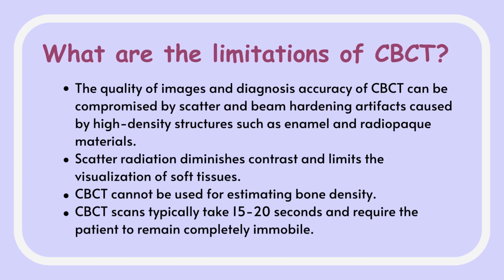What are the limitations of CBCT? The quality of images and diagnostic accuracy of CBCT can be compromised by scatter and beam hardening artifacts caused by high-density structures such as enamel and radiopaque materials. Scatter radiation diminishes contrast and limits the visualization of soft tissues. CBCT cannot be used for estimating bone density. CBCT scans typically take 15 to 20 seconds and require the patient to remain completely immobile.